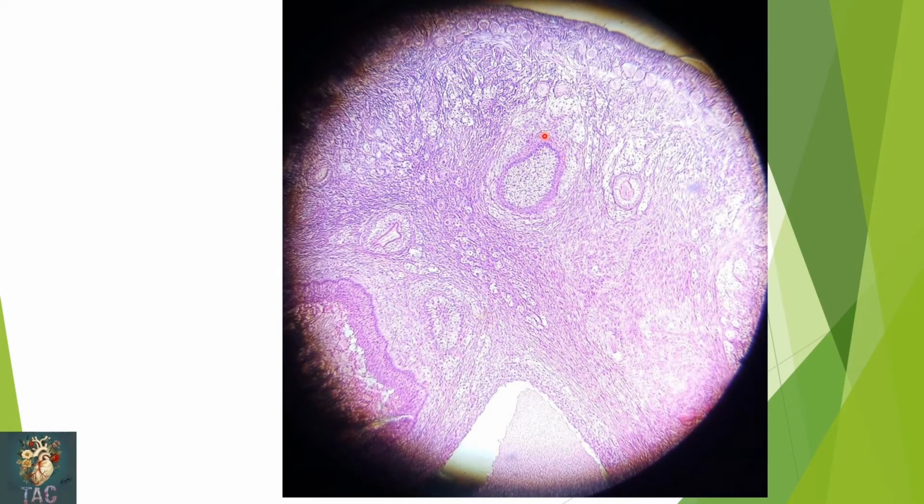Another section of the ovary, again you can see the epithelium, the connective tissue, the pool of primordial follicles, then some growing follicles, maybe a secondary follicle containing the antral space with antral fluid in it, surrounded by the granulosa cells. Another follicle which may be a primary follicle, the connective tissue is present over here, and these two are the Graafian follicles.